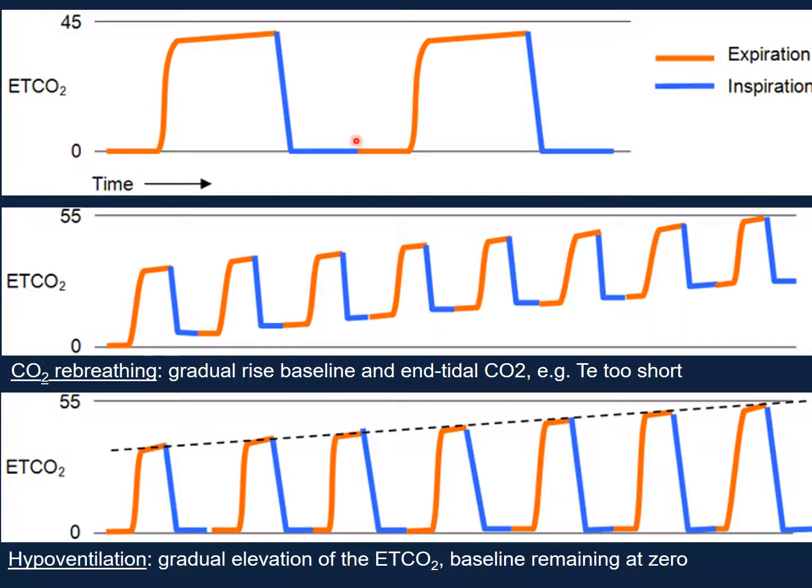Okay. So if you look at this graphic, the orange part, don't get confused. In this case, it refers to exhalation, because we are looking at the y-axis, which refers to the amount of carbon dioxide in the breath over time. So during exhalation, your CO2 will be higher, right? And then during inhalation, there will be less CO2 in the breath. Make sense?